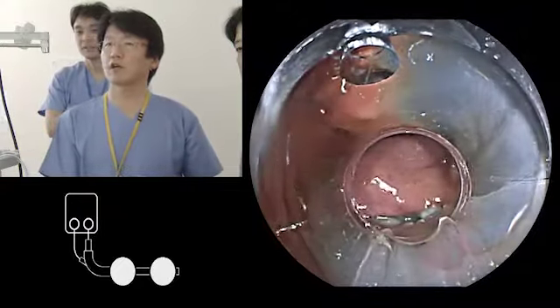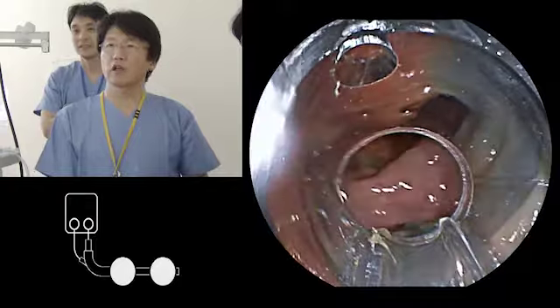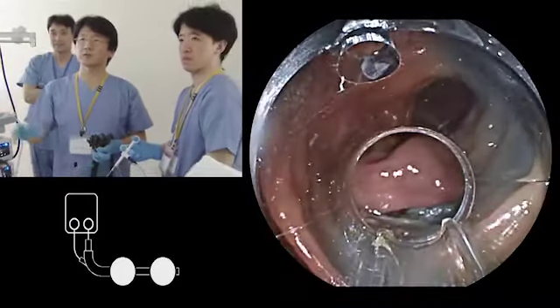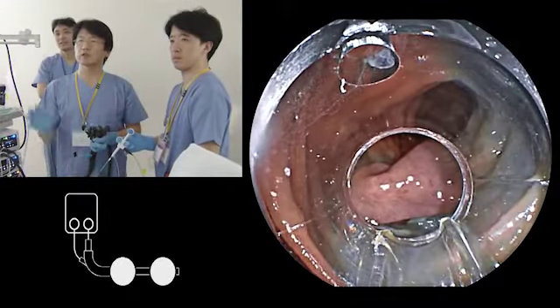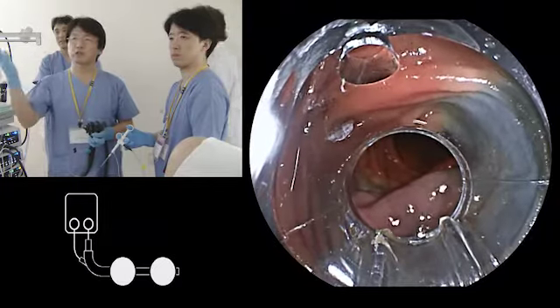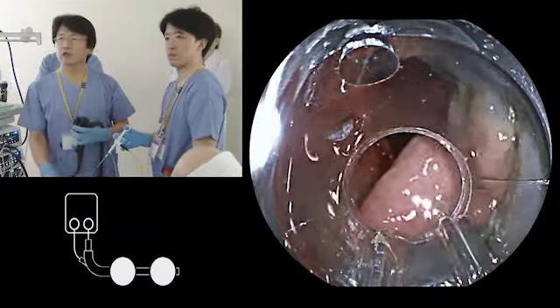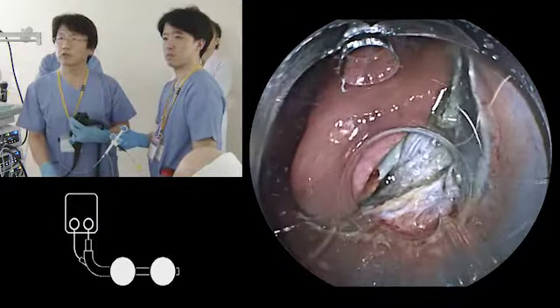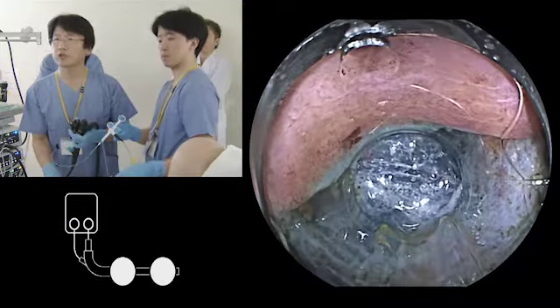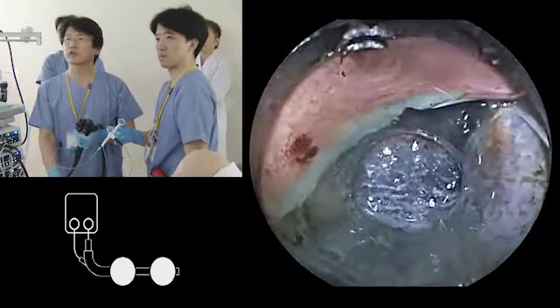I want to show the progress of the procedure. First of all, when you use the ST hood, the endoscopic view could be limited, so you have to apply lens cleaner on both sides of the ST hood. But once you go into the submucosal space, the tissue touches the surface of the ST hood, so the endoscopic view is very good.